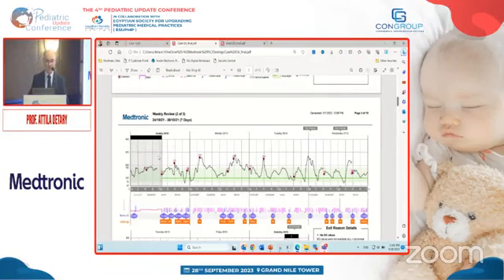Okay, so the patient, as I mentioned at the beginning, has to be in manual mode. This patient already used the sensor in the manual mode. And then on Sunday, 24th of October, switched to auto mode. And you can even see this difference in the basal rate. So the pink horizontal line is the basal rate in the manual mode. So that's the pre-programmed basal rate I program for the manual mode.